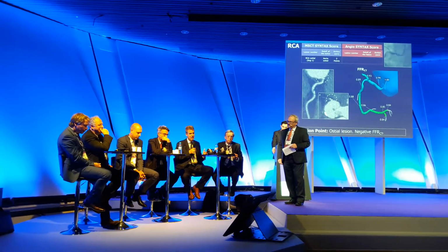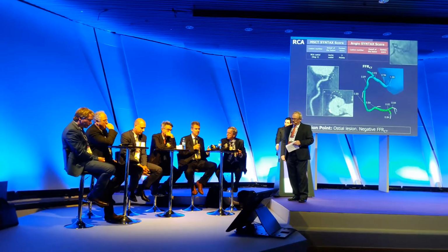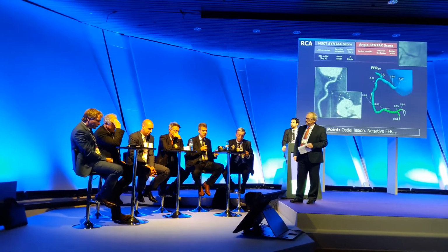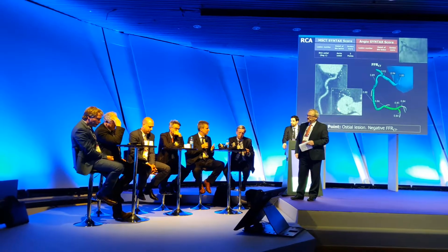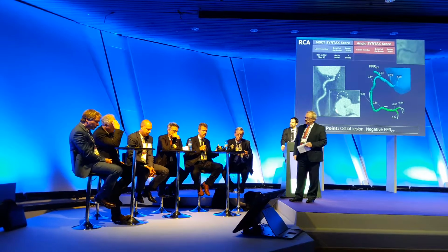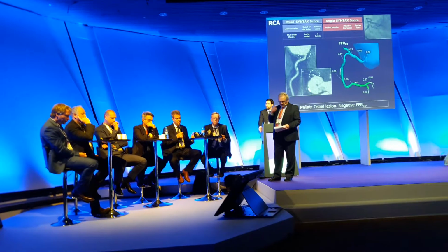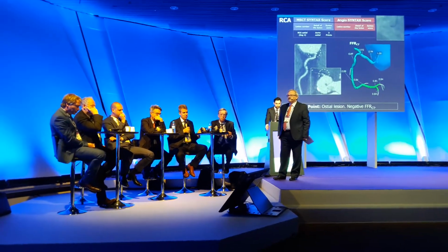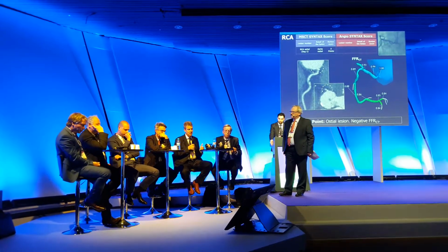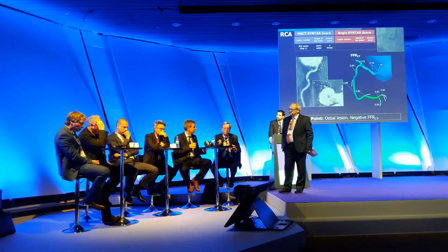So it's very interesting that, as Carlos has shown now, the FFR-CT is negative and excludes a flow-limiting effect of this lesion, in agreement with the invasive anatomical evaluation. Therefore, I think it would have been very useful in this case to compare CT images versus invasive intravascular ultrasound in terms of anatomy, and the functional FFR-CT data with the gold standard represented by the invasive FFR.